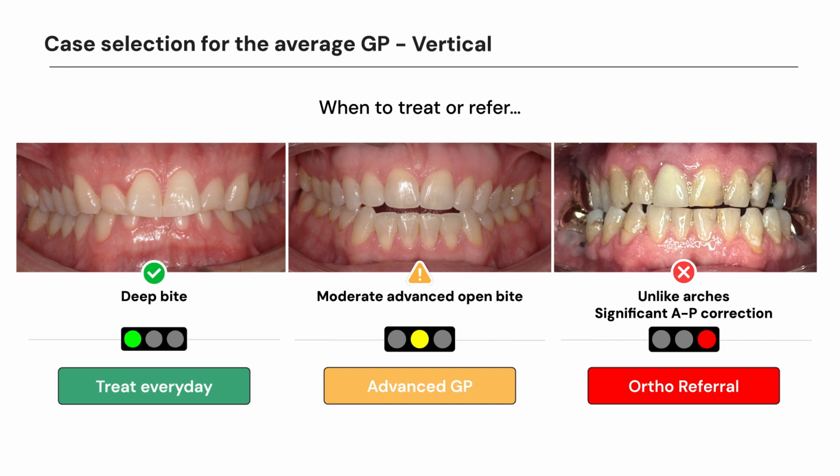We're gonna get some cases under our belt before we do that, because we're gonna upright these arches and end up with some spacing that would be associated with it. We can manage all that, but again, a little bit more advanced for us. How about this next one here?